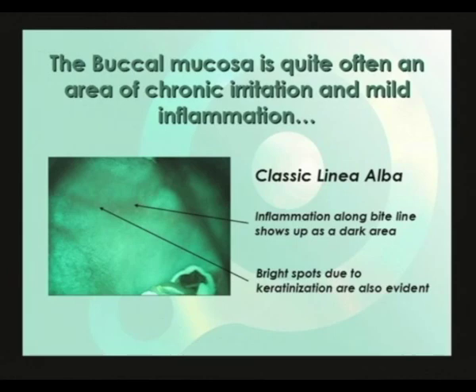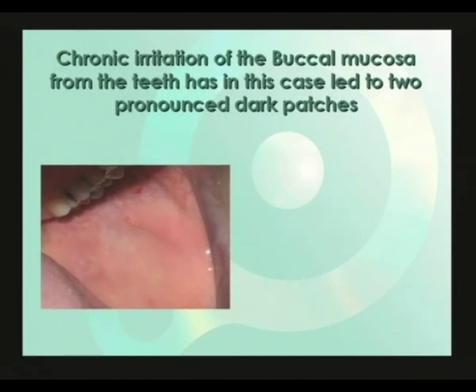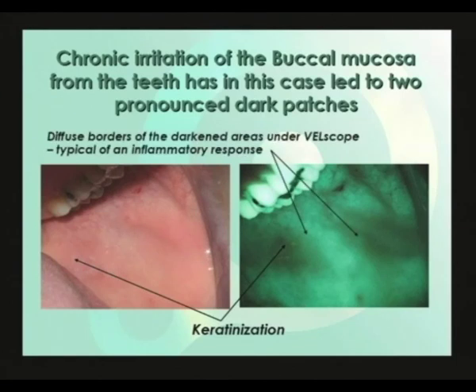This is typical of inflammation. Chronic irritation of the buccal mucosa from the teeth has in this case led to two pronounced dark patches rather than a line. Still the principle is the same — again notice the diffuse borders of the dark inflamed areas under VELscope.